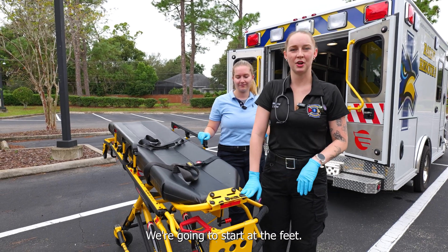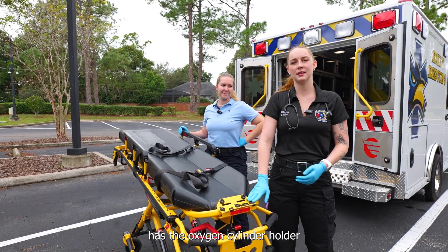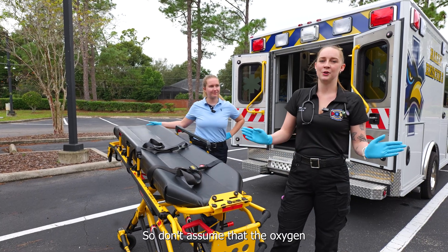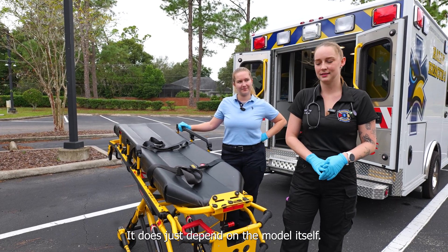Typically we can hold an oxygen cylinder at the feet of the stretcher. I want to reference that this specific model has the oxygen cylinder holder at the feet. Some models do have it at the head. So don't assume that the oxygen is always going to stay at the foot or the head of the stretcher — it does depend on the model itself.